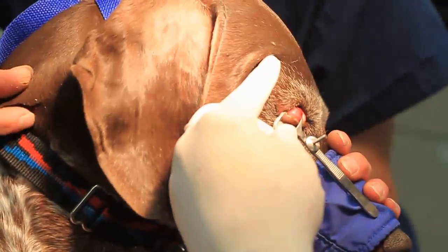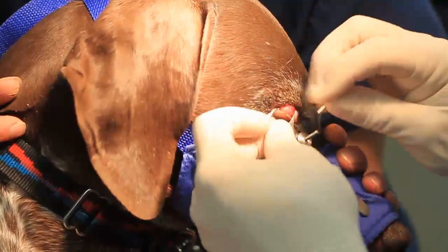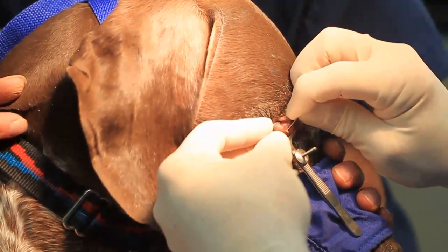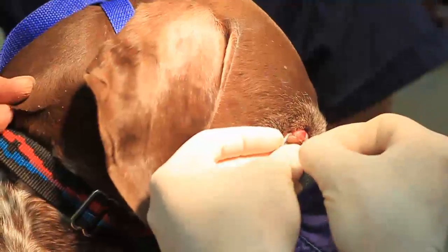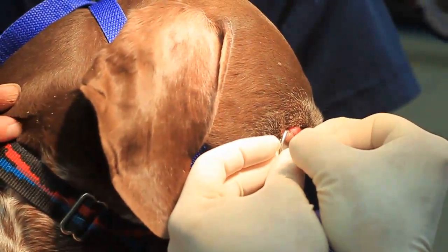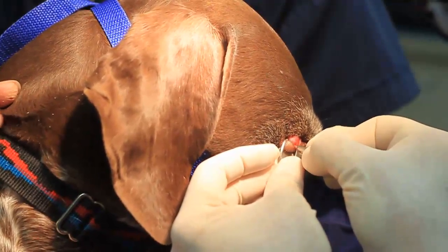I didn't take much lidocaine. Now what I'm going to do is come in here and carve this little meibomian gland out of here — create a little trough where the meibomian gland is.